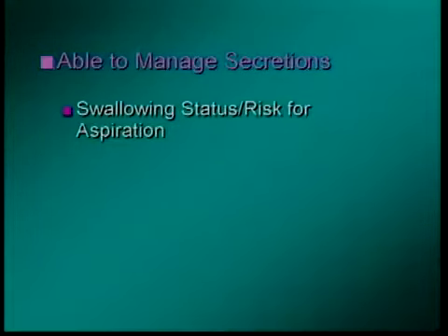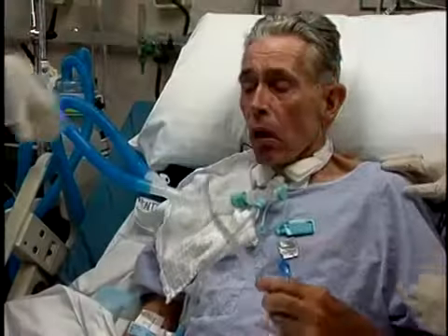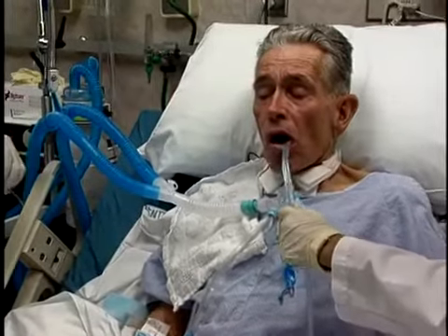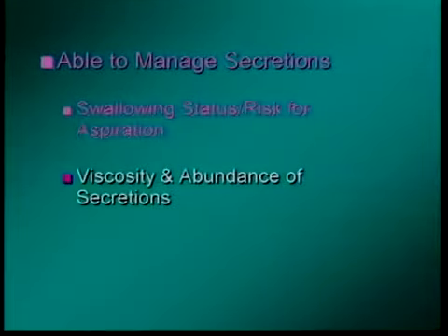Due to the restoration of a closed system, use of the valve can facilitate mobilization and oral expectoration of secretions and improve bronchial hygiene. Secretion viscosity is more critical than quantity when considering valve use. The ability to manage differences in viscosity and quantity of secretions will vary with each patient. Patients have reported their suctioning needs have decreased from every 20 minutes to 3 to 4 times a day with valve use.